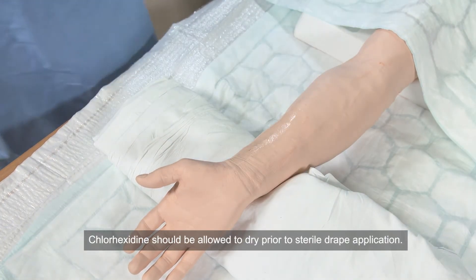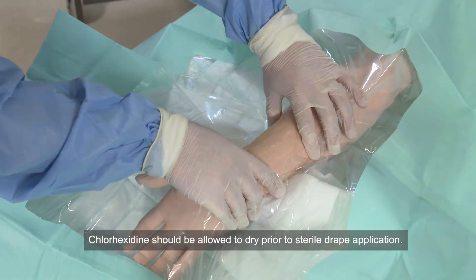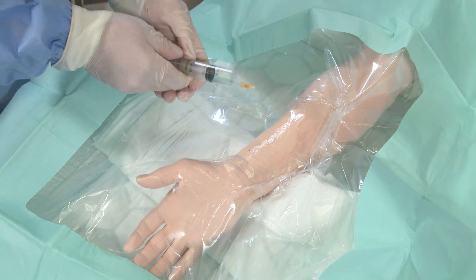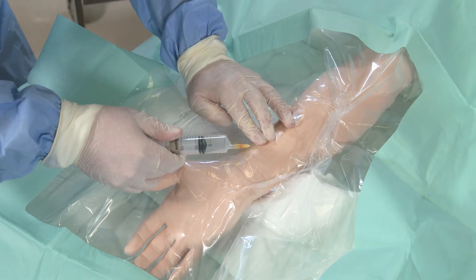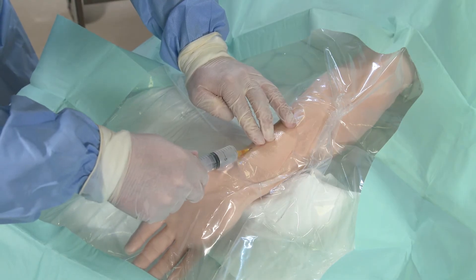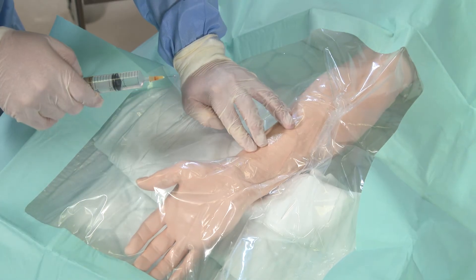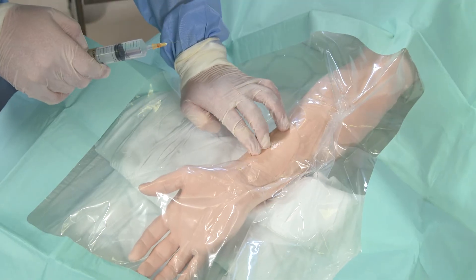Then cover the site with a sterile drape. The next step will be to anaesthetise the site with 1% lidocaine. Palpating the artery, insert the needle — warning the patient there will be a sharp scratch — and raise a bleb with about half a mil of 1% lidocaine. Following this, massage the site in order to disperse it around the tissues and give yourself easier access to the artery.